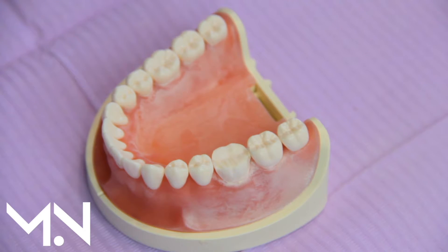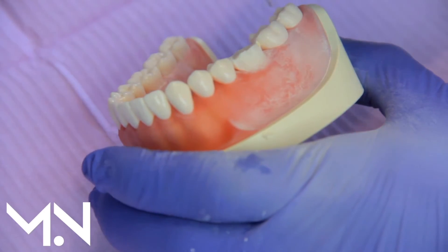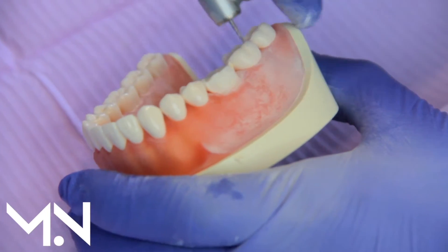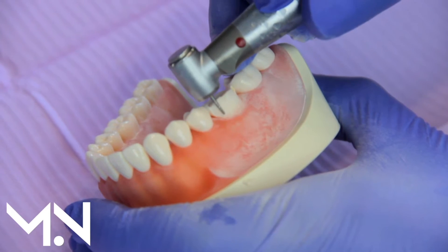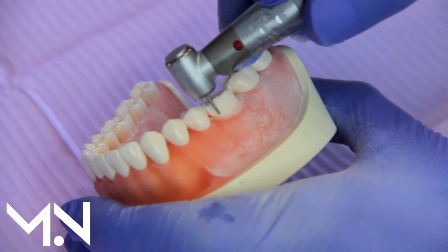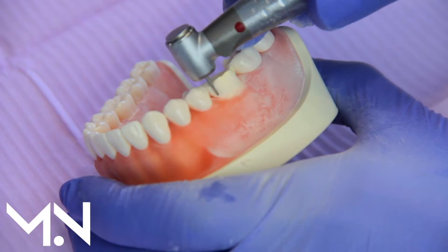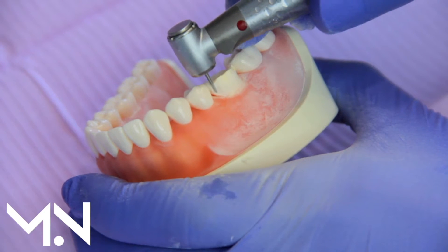With a crown procedure you have to go near the gum in order to have space for the crown. If you don't go near the gum you won't have enough retention to hold the crown in place. But if we use adhesion we wouldn't need to take away that area near the gum — our retention comes from the glue, so we can use adhesion to keep the restoration on instead.